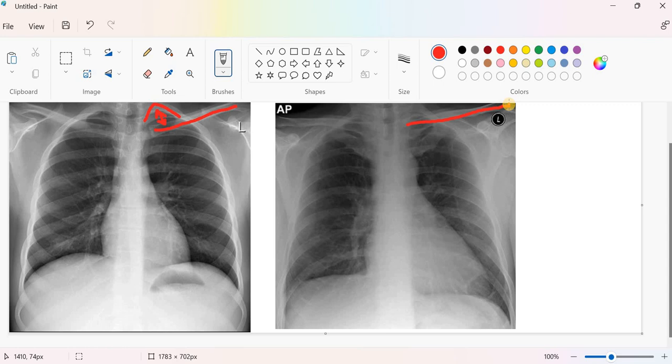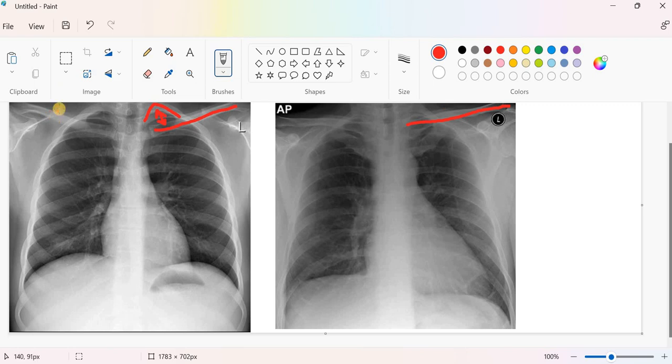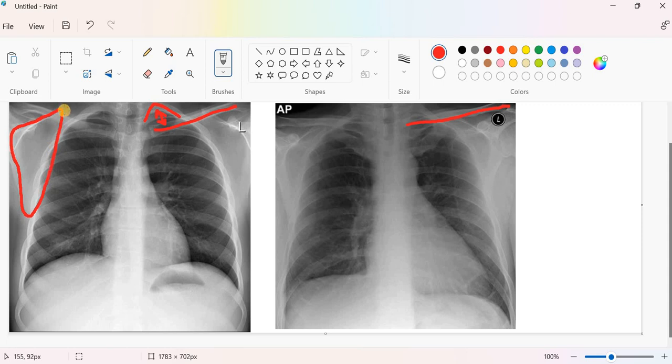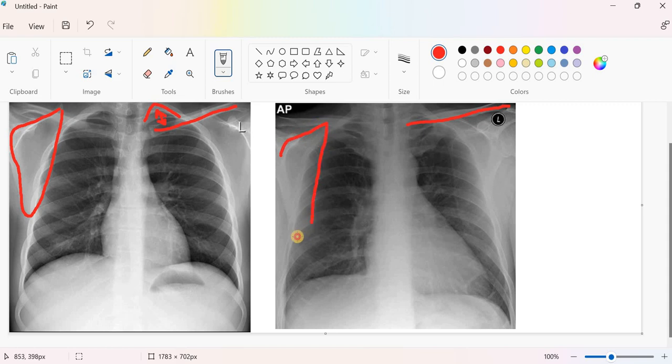This is number one. Number two, if we look to the scapula in the posterior anterior view, you will find the scapula is at the periphery of the image. While in the anteroposterior view, part of the scapula is slightly encroaching on the lung image in the chest X-ray.